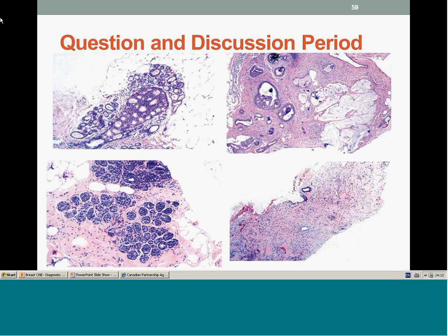Because they all look atypical in some way. But if you see atypia in those lesions, then they need an excision. They may not turn out to be cancer. Some of them turn out to be maybe just atypical apocrine adenosis or something to that effect, but they need an excision. As I said, really, the management goal is a low threshold for excision. We're not quite at the refinement yet where we can say these you can watch, these you cannot. But I think they do need probably some second review and consensus within the group, and then run an excision if it's that.